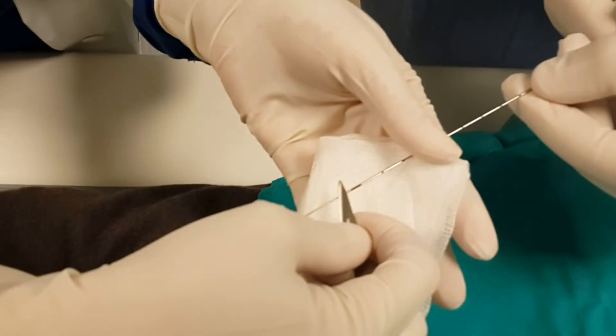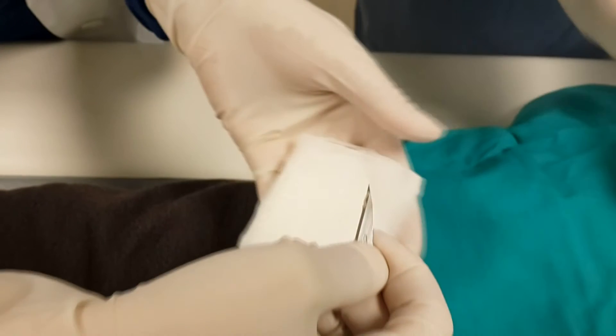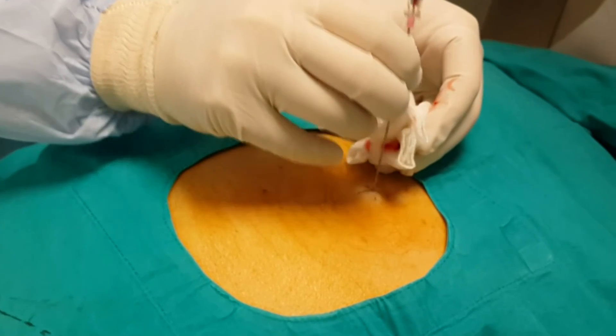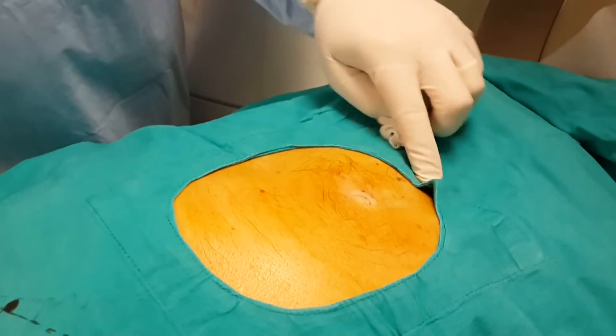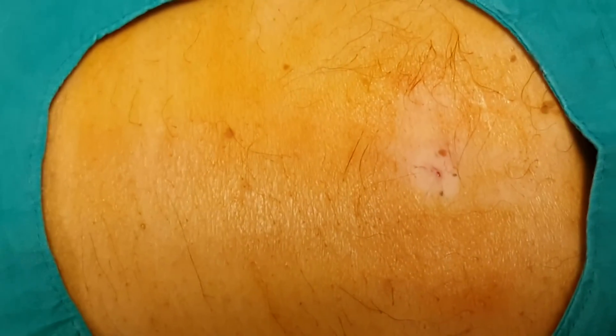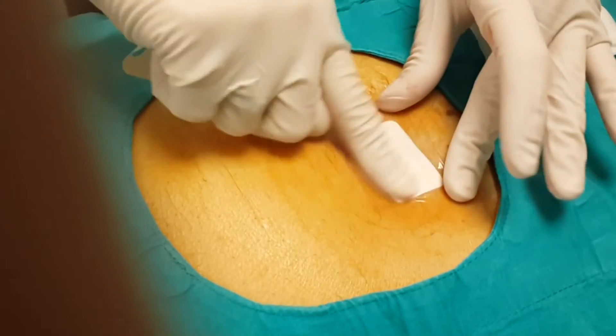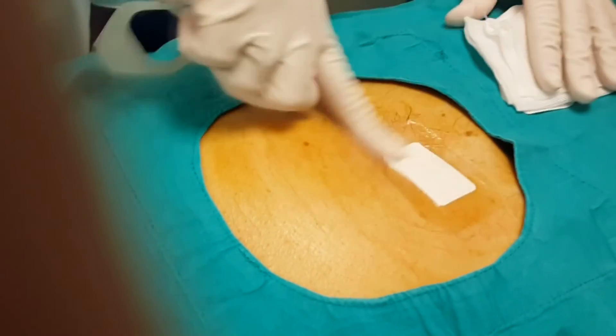After all the samples are obtained, we put them into a small box and send them for pathologic evaluation. After the biopsy is completed, we remove the needles and put a sterile dressing on the puncture hole. The pancreatic biopsy is finished. The patient will be observed for a couple of hours and discharged if there is no problem.